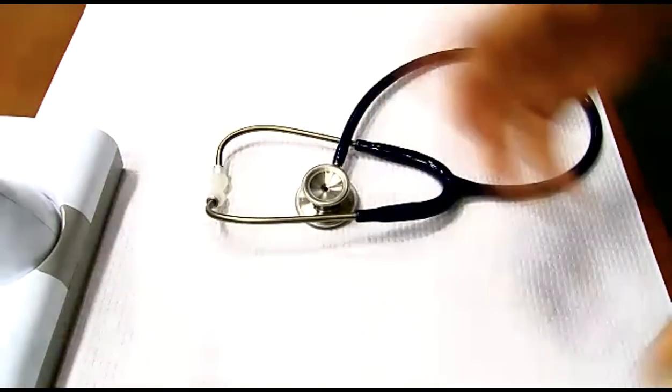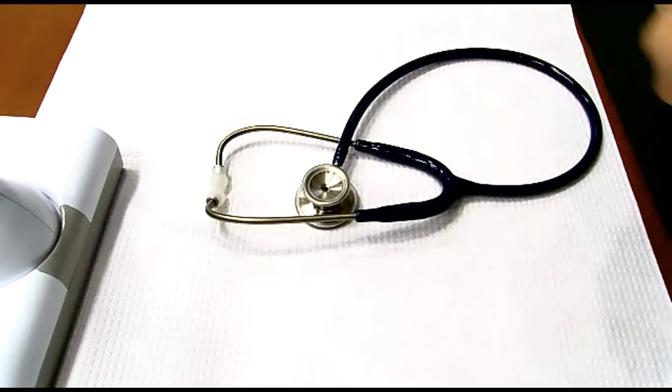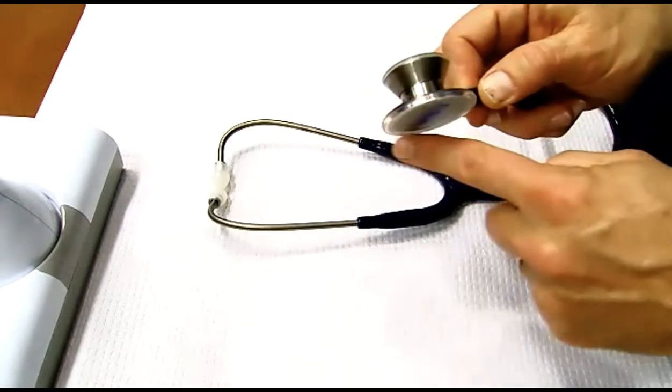What about blood pressure? That's the whole point for you guys, right? Blood pressure, I will tell you, either. Use the one that works best. They conduct sound slightly differently, and so some of you will be more successful with one or the other. I would tell you from my experience, about 65% of students do better with the diaphragm.